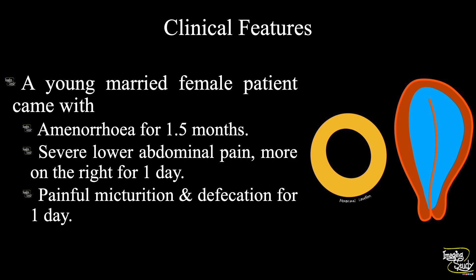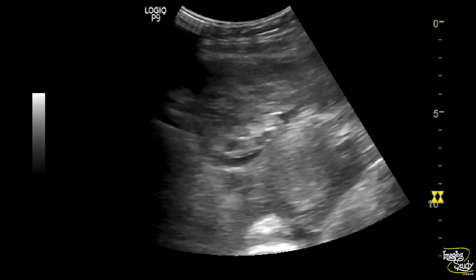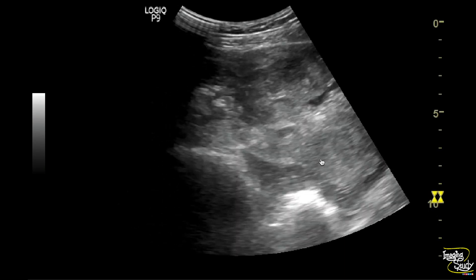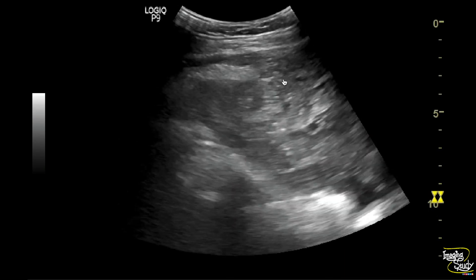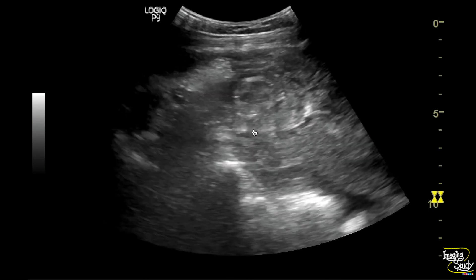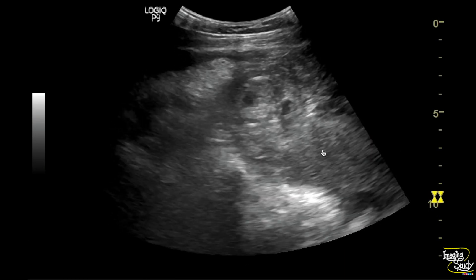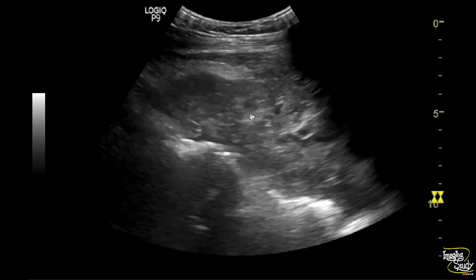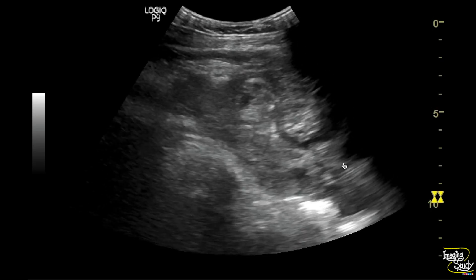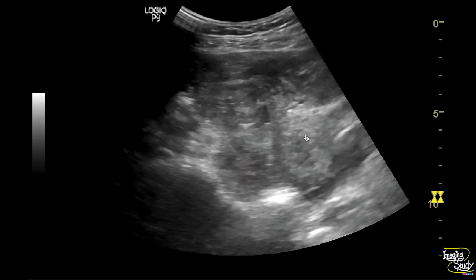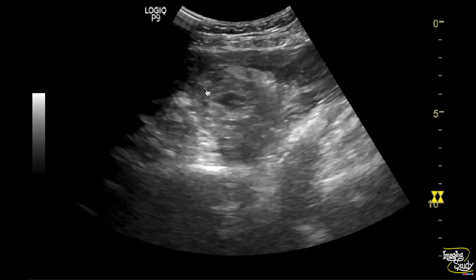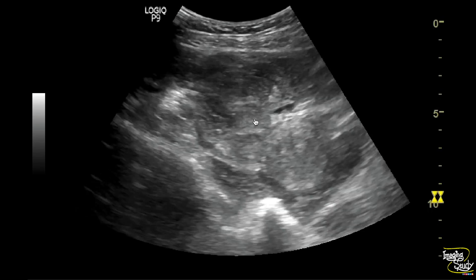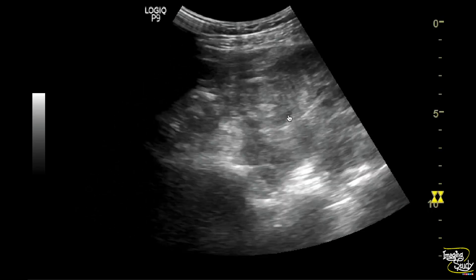Let's see what we have got on ultrasound. Here you can see the transverse section view of the pelvic region showing a complex mass adjacent to the uterus. This structure is the uterus, and you can see this heterogeneous complex area with two internal cystic components.